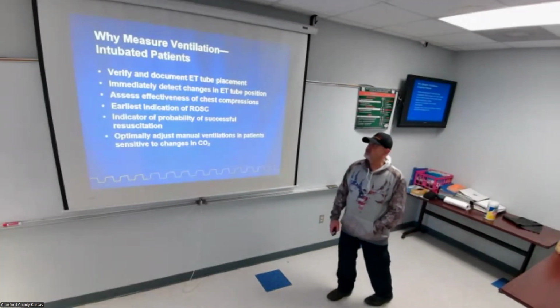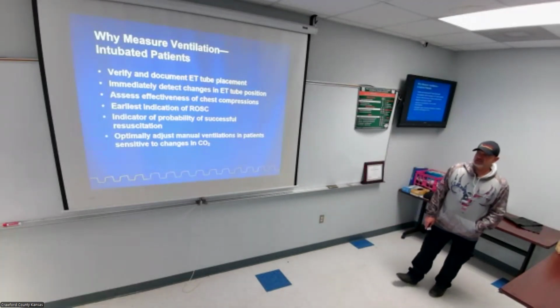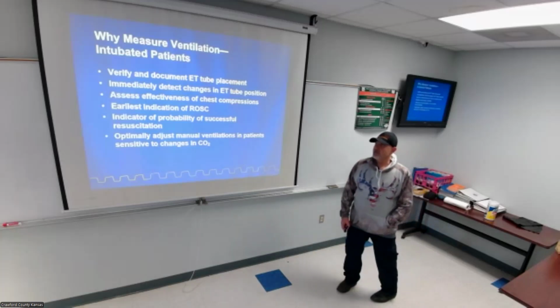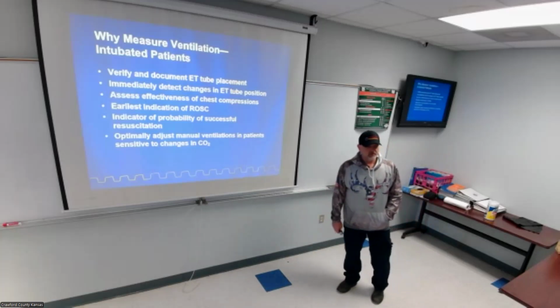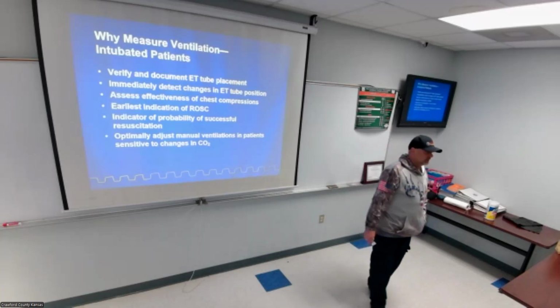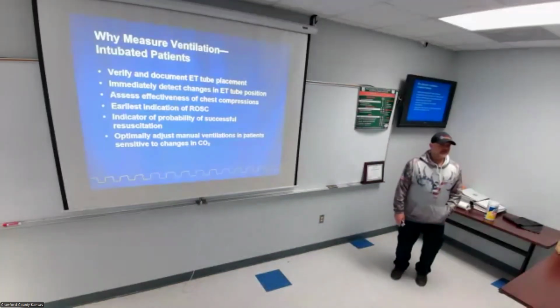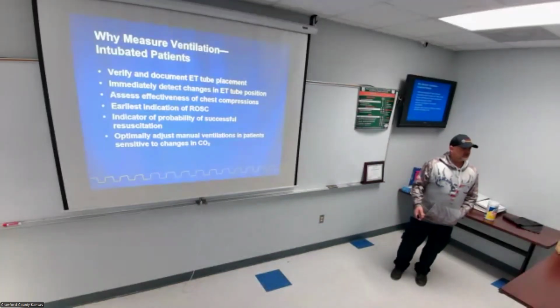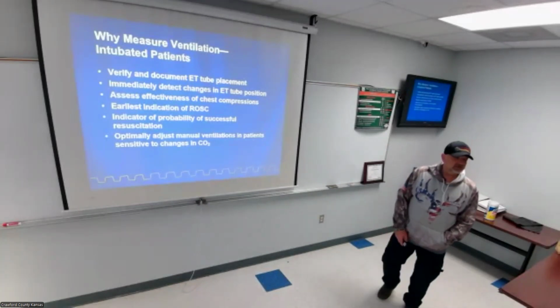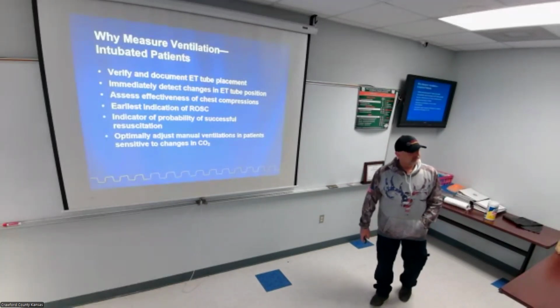You can assess effectiveness of chest compressions with end-tidal CO2. It's the earliest indication of ROSC. One thing we were doing in Texas is you didn't have to feel a pulse. If you've got a ROSC jump, our medical directors were like, stop right there, you have a heartbeat, regardless if you can feel it or not. At that point, we started pushing the epi drips to try to bring it up to where we can actually palpate it. Without a ROSC, if you have a ROSC jump, you have a heartbeat.